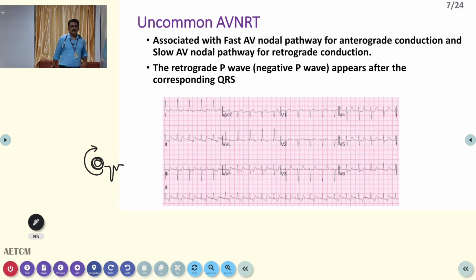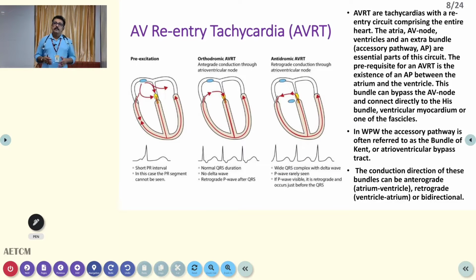So, we don't read this slide at all. For usual MBBS or postgraduate learning, this is not very useful. But for a cardiologist, this type of finding may be very useful. So, we don't discuss this type of thing in our class because we are going to treat these patients with tachyarrhythmia only. We are not going to make a complete diagnosis from the ECG.